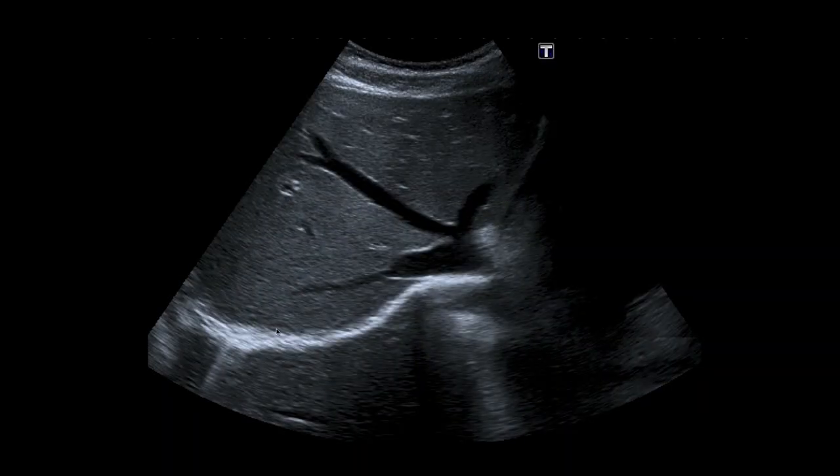Do you remember the liver segments in our chapter of liver's anatomy? We want to take a look at them again, but this time in ultrasound pictures. Let's get started. Here we've got a lovely picture of the liver and the liver veins. The middle one, the right one, and the left one.